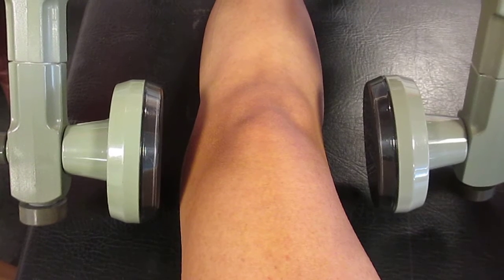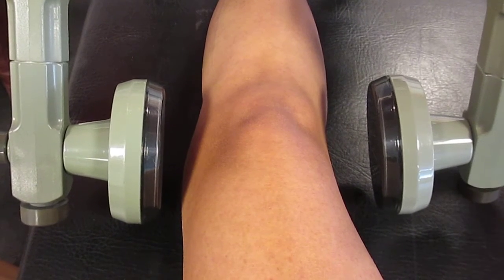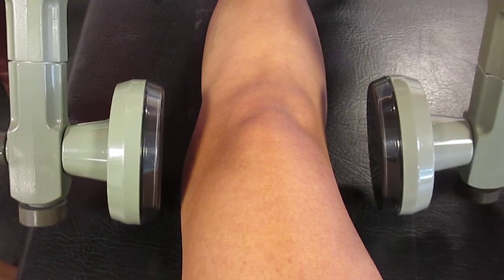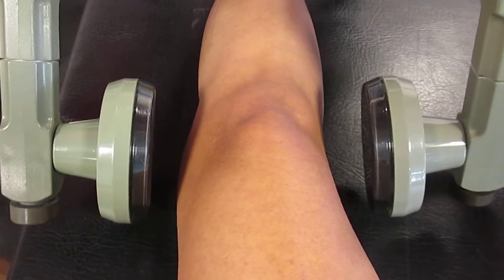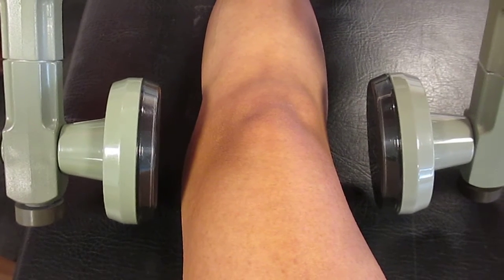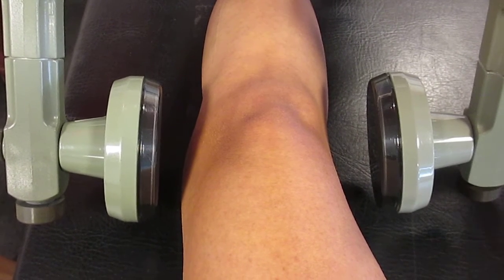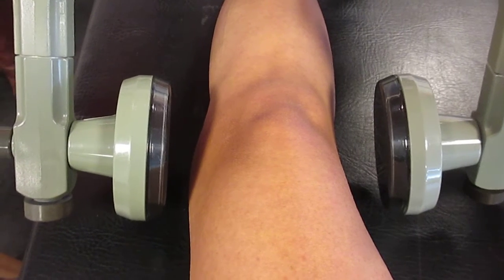Prior to setting up these electrodes, you would check that your patient had no contraindications to treatment. You would check that you had consent to treatment from your patient. You would inform the patient what they should be expecting from the treatment, and you will have tested their skin sensation using the test tubes.